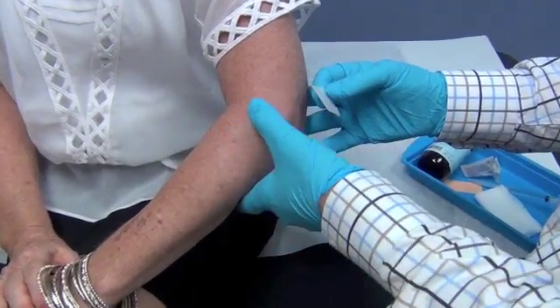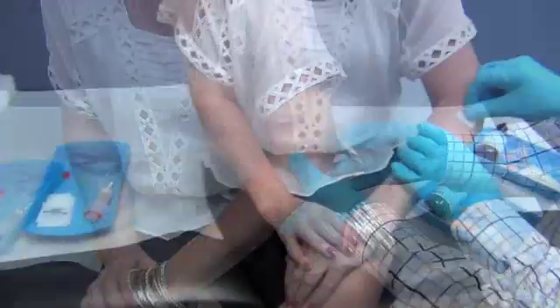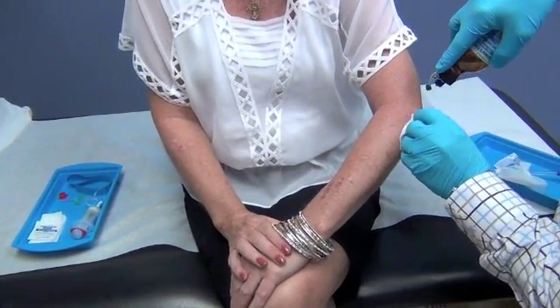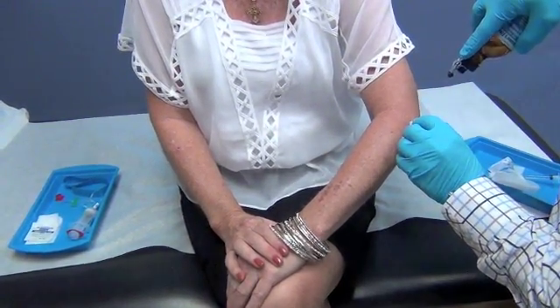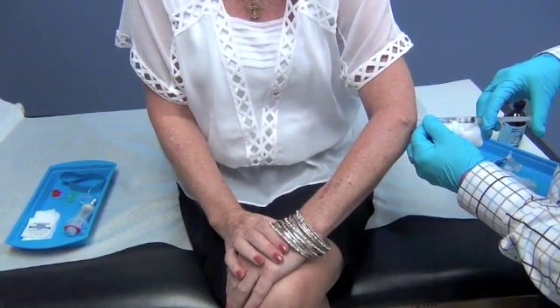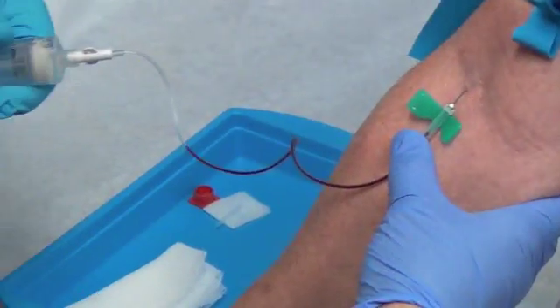The first thing we're going to do is prepare the area where we're going to be placing the injection into the common extensor tendon. There's a little bit of alcohol and this is some ethyl chloride to numb the skin. We're numbing it in preparation for an injection of lidocaine, which is a local anesthetic into the area. We'll make a little bubble there, which will make that area numb when we do the injection later.